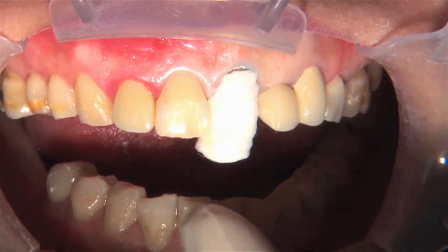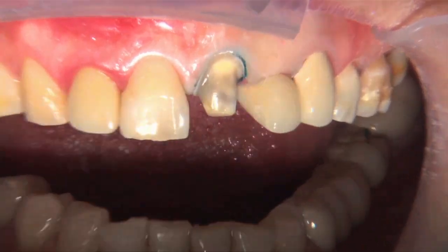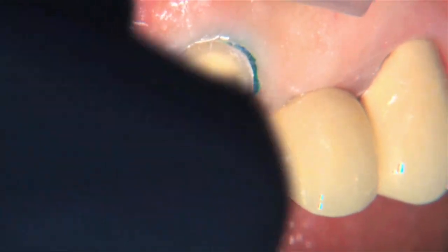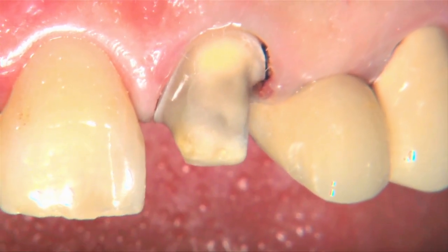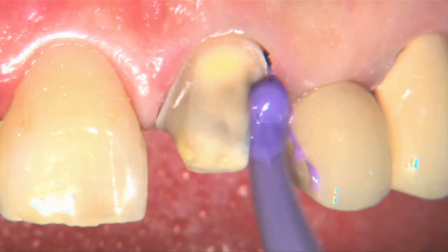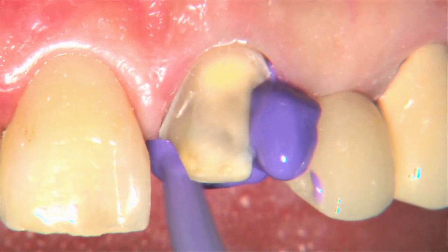8 to 10 minutes later, my phone vibrates in my pocket, and I know it's time to take an impression. And so we're going to pull that number two cord out. There's my assistant pulling it out. You can see already we've got a great wide open sulcus. As I squirt that wash material, you can see it move forward in the sulcus ahead of where I'm actually squirting it. And that's the benefit of this two cord technique.